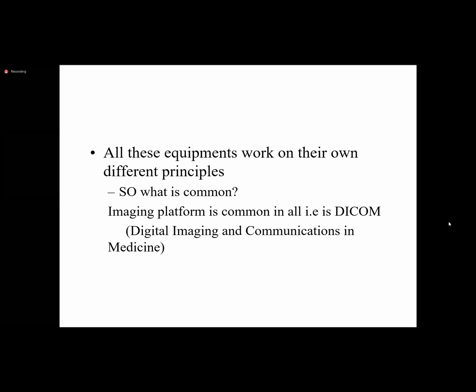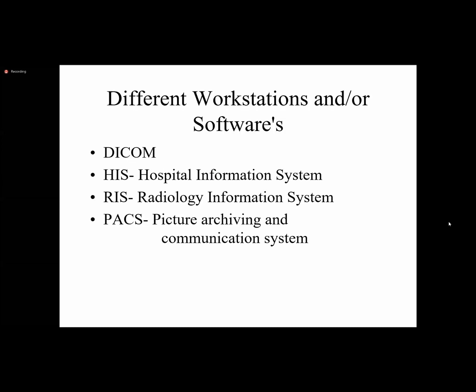The common thing in all these equipments is DICOM. DICOM is Digital Imaging and Communication in Medicine. The different workstations have their different software. Also, there is common software we use in hospitals nowadays, that is HIS, RIS and PACS. HIS is the Hospital Information System, where we enter the details of the patient from when they walk into the hospital until they walk out. All the details we put into the HIS software.